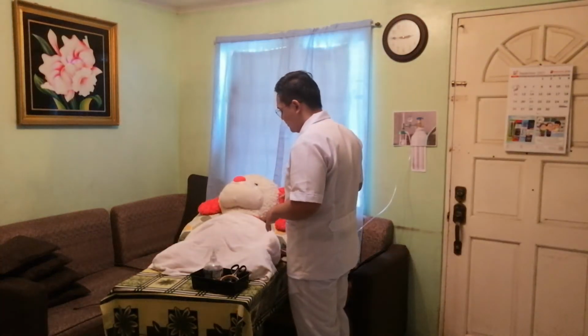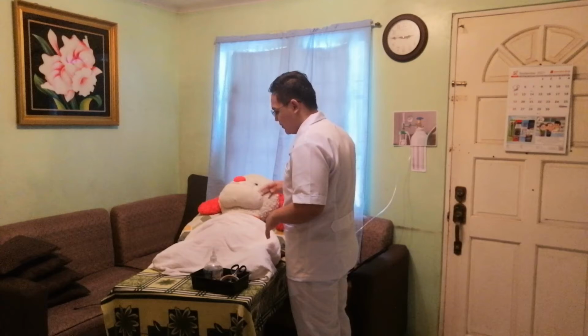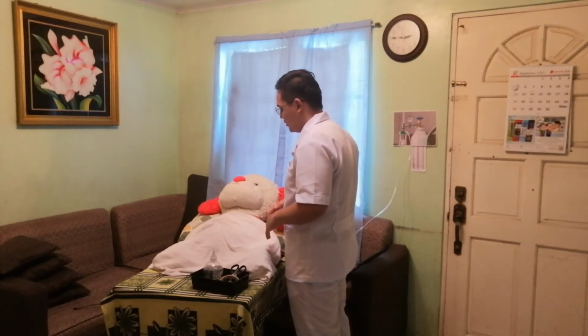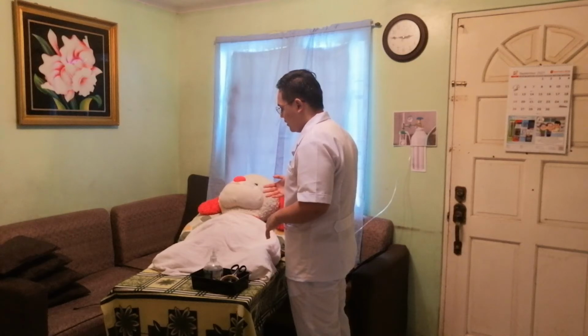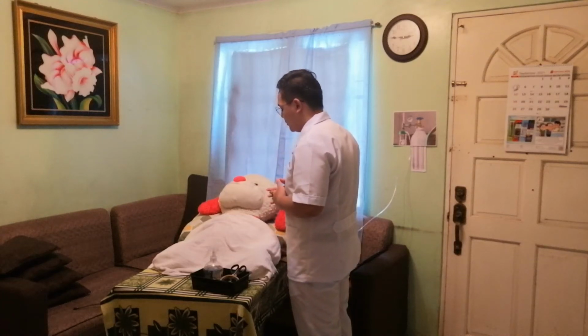So, ask ko lang po ma'am if you are experiencing irritations and discomforts po coming from the outlet prongs. Okay. So, wala naman po. And if you have any concerns po or discomforts, just tell me po, as we could put a water-soluble lubricant po sa ating pong prongs.